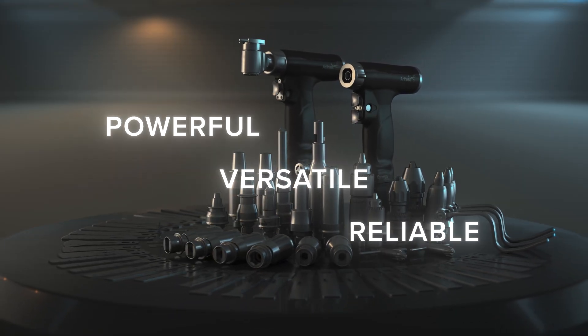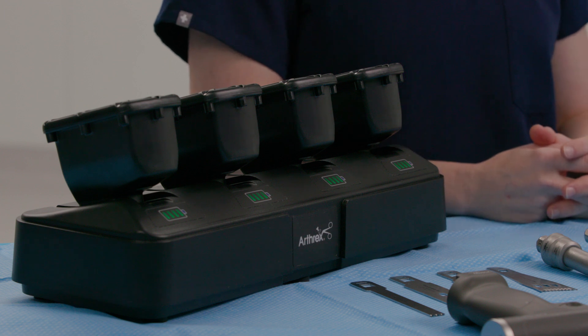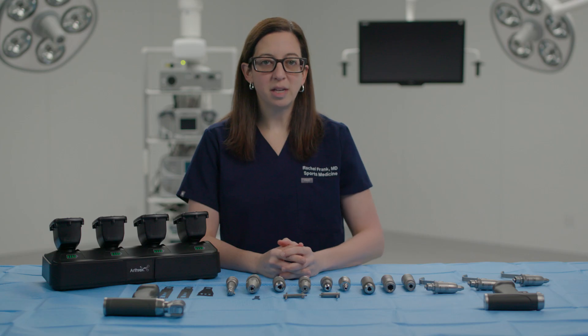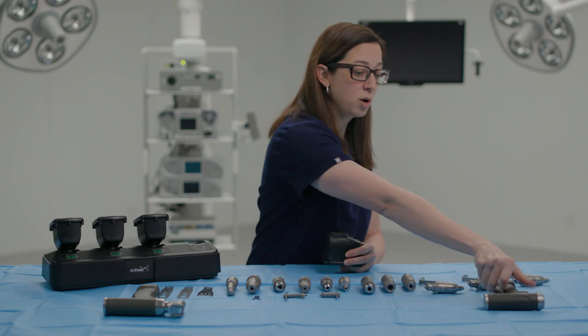Let's discuss the Synergy Power battery packs and charger. The battery packs are sterilizable and offered in both a small and large size — small for light-duty procedures and large for heavy-duty procedures. The charger has a simple user interface to easily determine the state of charge and offers fast charging, charging a small battery pack in up to 30 minutes and a large battery pack in about 120 minutes.